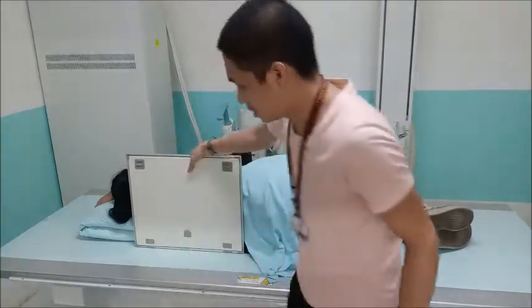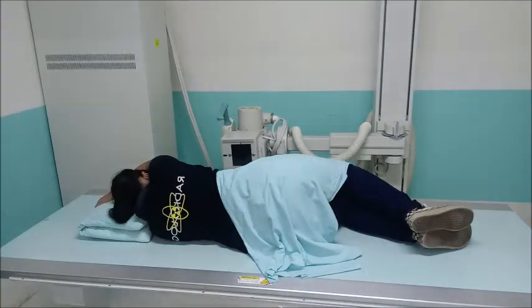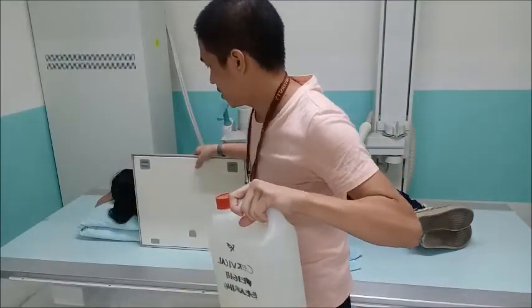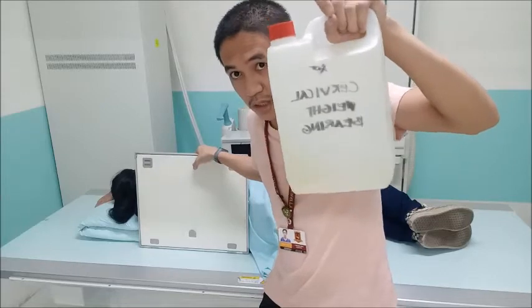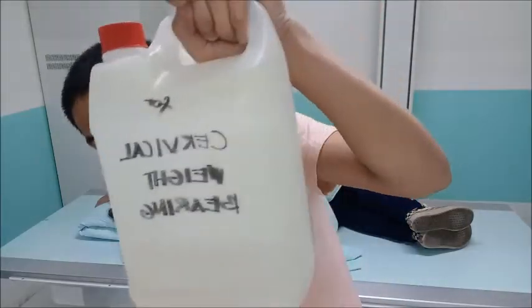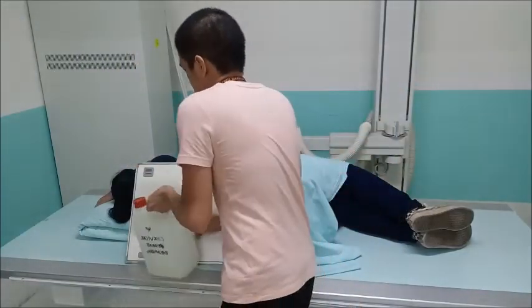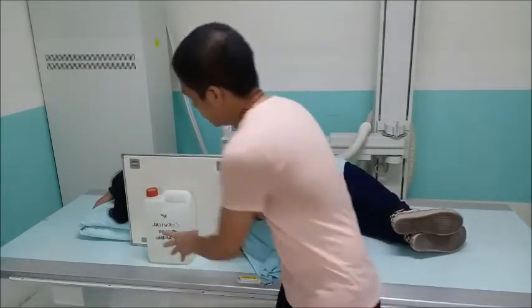Okay. So to hold that in place, you can use sandbags, or in this case, there are no sandbags, but there are these water jugs labeled cervical weight bearing. Okay.